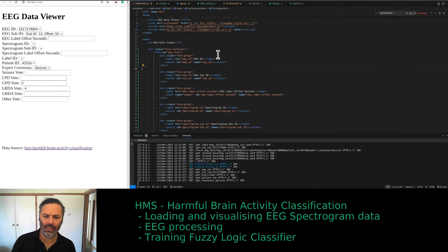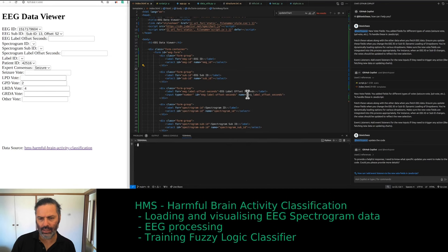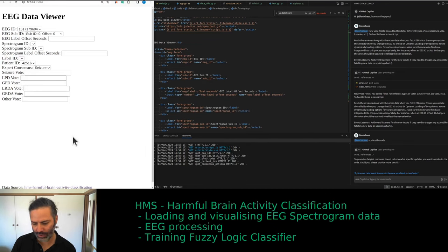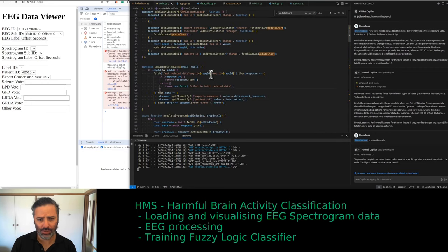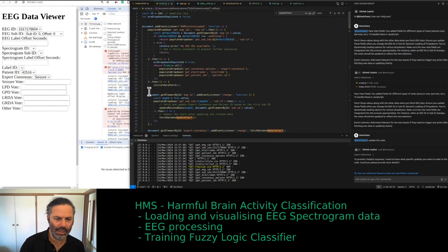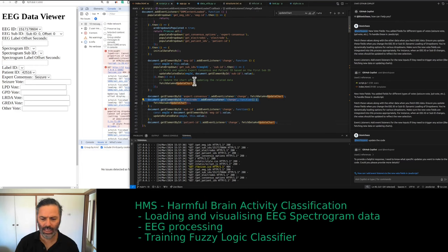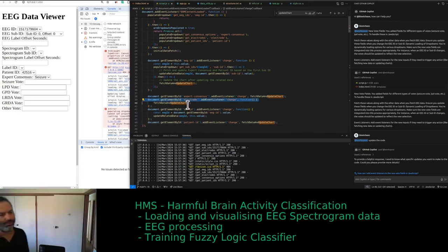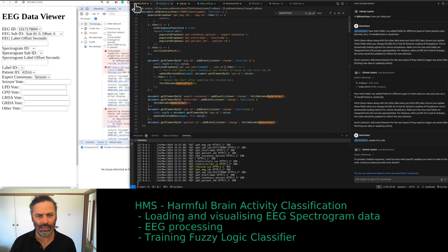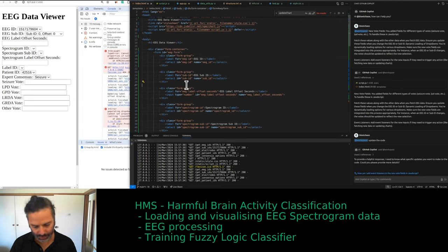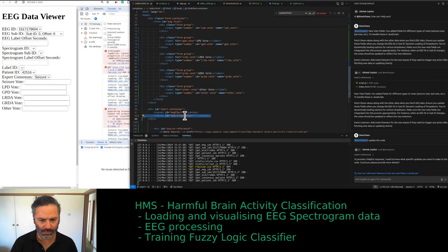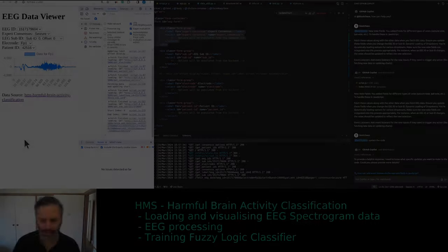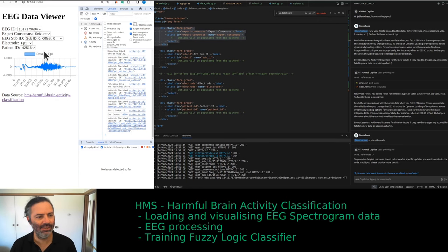Looking at the errors — it would be in the JavaScript. Script.js line 39: electrode should have been there. That was too ambitious. Let's go back to the HTML we had before, and we'll add the spectrogram separately.